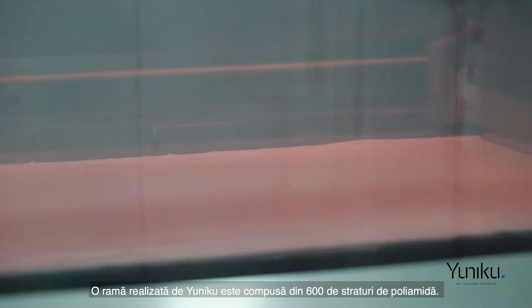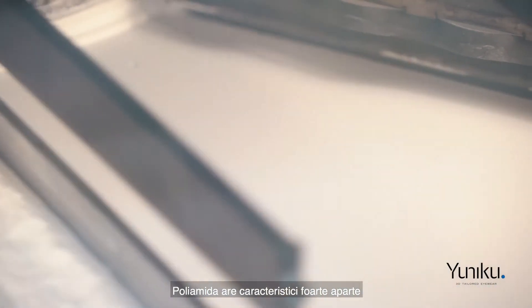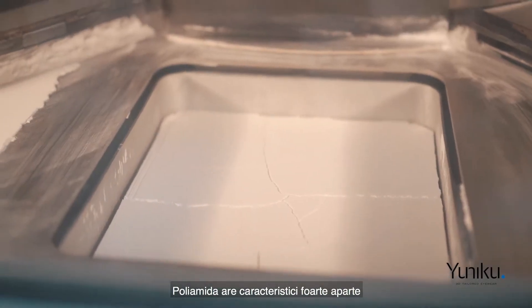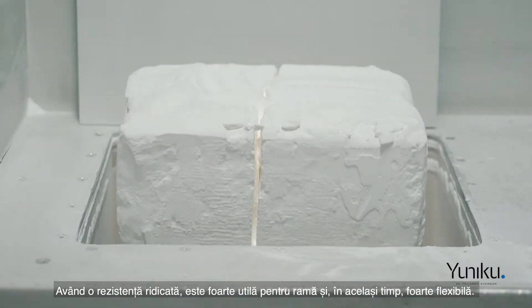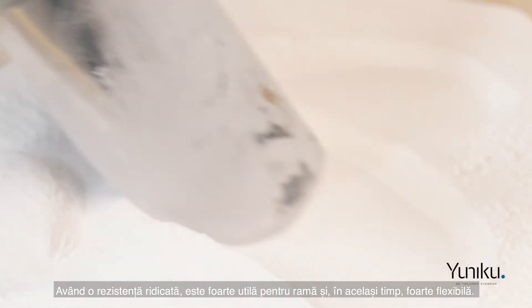A frame made by Yuniku is built out of 600 layers of polyamide. Polyamide has very specific characteristics — it's very strong and therefore very useful for eyewear, and at the same time very flexible as well.